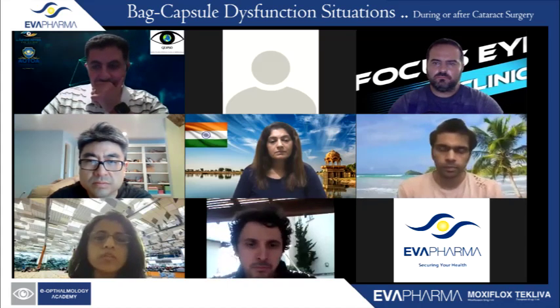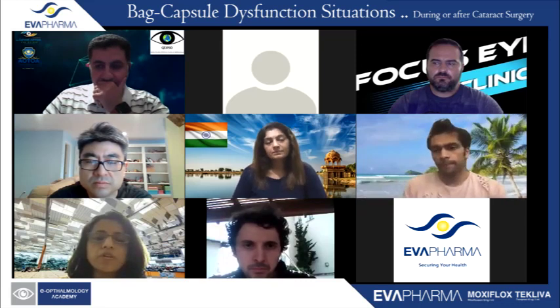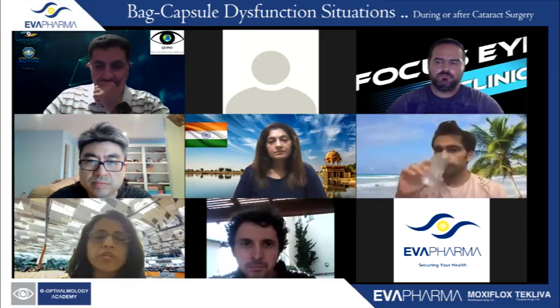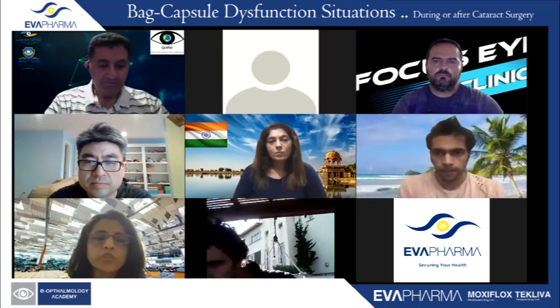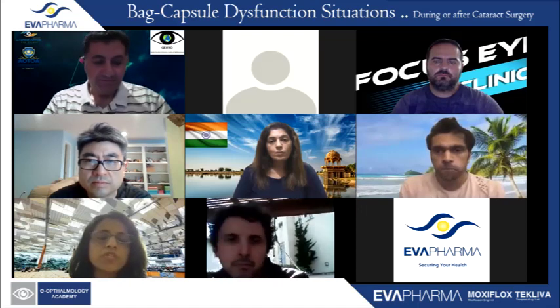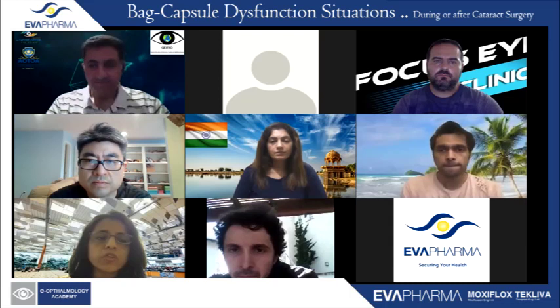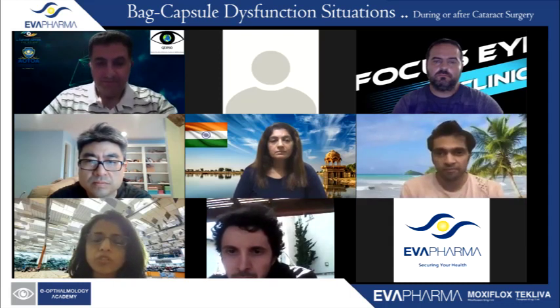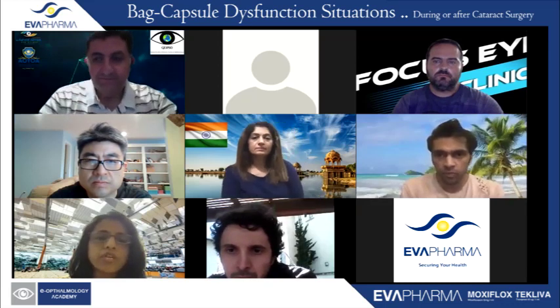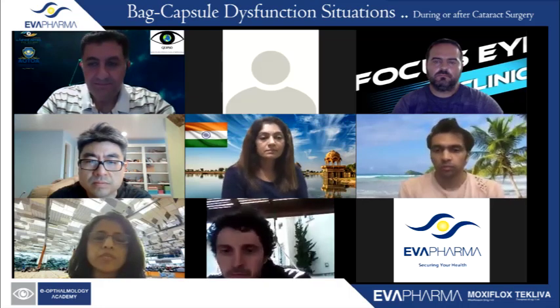The other thing is that if you're doing a glued IOL or Yamane or anything where you make sclerotomies, remember that it's always important to have infusion going into the eye. You've done some amount of vitrectomy, the eye starts becoming soft, and the sclerotomies may start bleeding and you can get intraocular or vitreous hemorrhage. At that point it's important that you don't let the eye go into hypotony. Some people use viscoelastic to avoid that. I prefer using an anterior chamber maintainer with infusion, and that gives me better control over the eye.